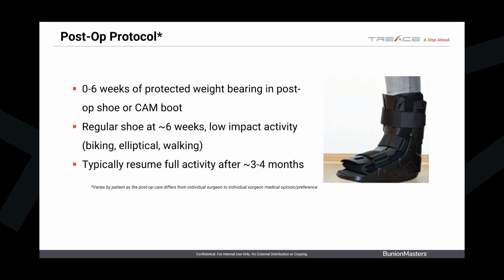There are other individuals that feel more comfortable putting patients in a cam boot, which I have nothing against. Just keep in mind, if the ankle is not plantar flexing or dorsiflexing, the natural soleus pump is not working. So there can be a little bit more edema collection on patients that are in a cam boot.